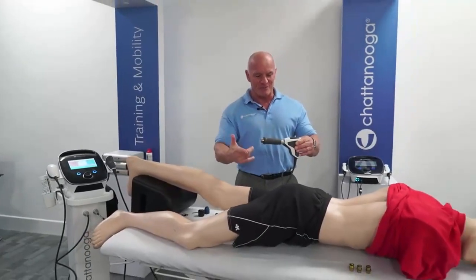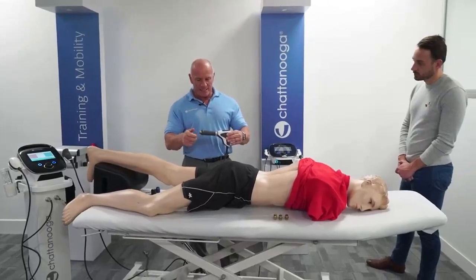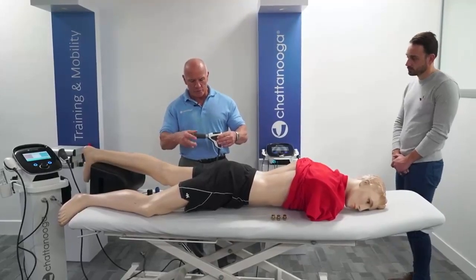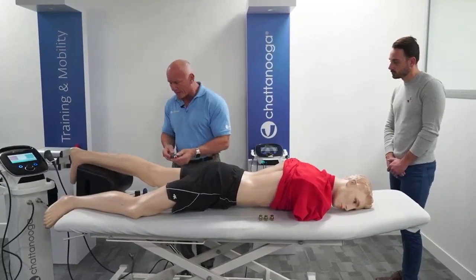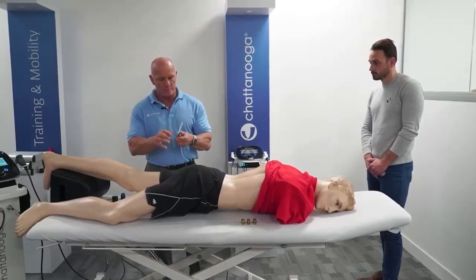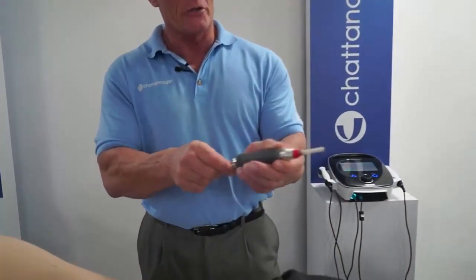While the kettle is boiling, come in, get your handpiece. Unscrew the transmitter. Unscrew the barrel. It comes complete with a wire brush, which you simply place in the end and push through 2 or 3 times.